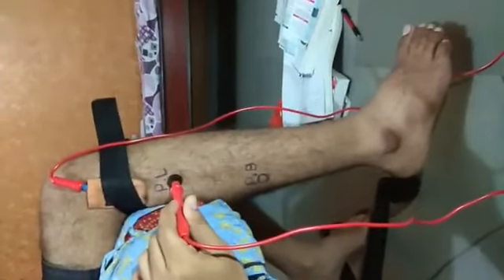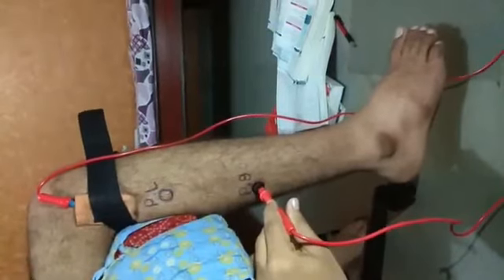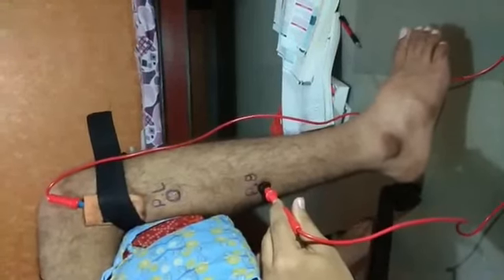This is the motor point of the peroneus longus muscle, and the action is eversion of the foot when the foot is off the ground. This is the motor point of the peroneus brevis muscle. The action is eversion of the foot when the foot is off the ground.